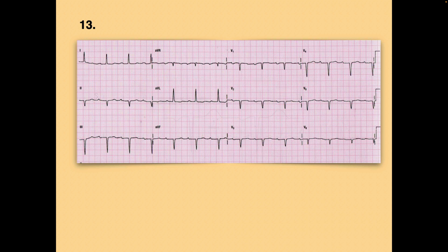On that continuum we saw when the T wave flipped, does that mean the repolarization is going in the opposite direction? I'm not sure. I'm just going to kind of scoot out from under the question. T waves are what's called very labile.